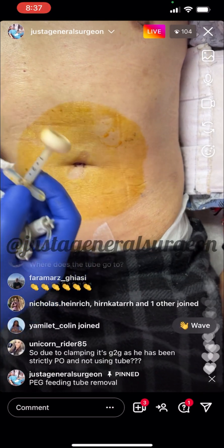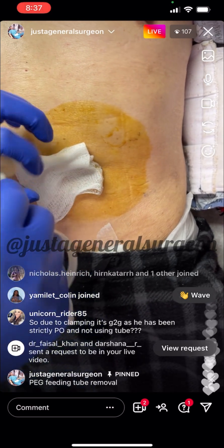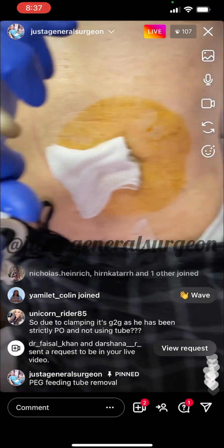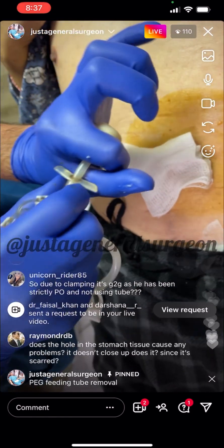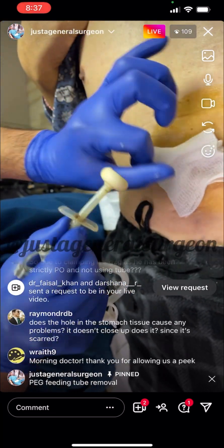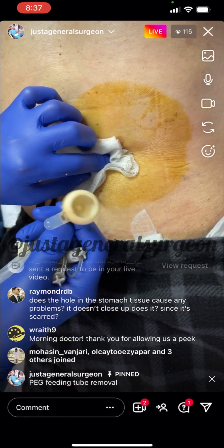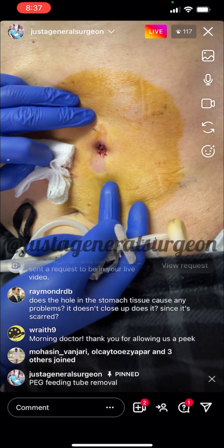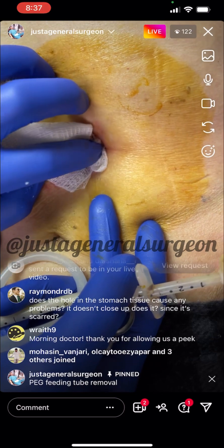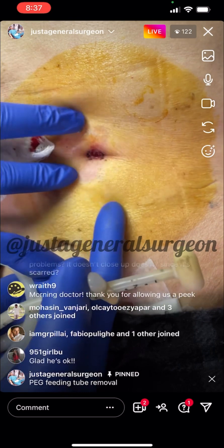This little bumper was underneath the skin — it was inserted into the stomach. Here's the skin, here's the opening. This bumper was underneath the abdominal wall, inside the stomach. You just have to do a firm pull to get it out. Here is the entire thing intact, so we know it has not fallen apart and is completely removed. And here is the gastrocutaneous fistula — the opening left behind.